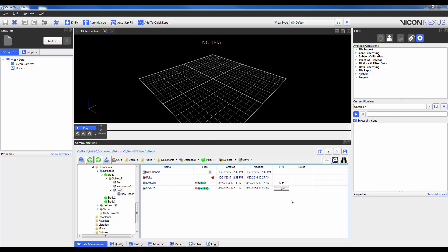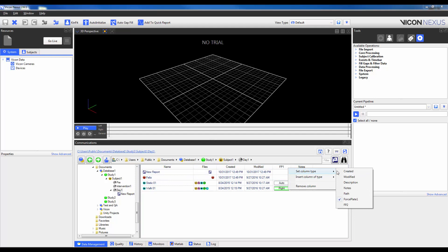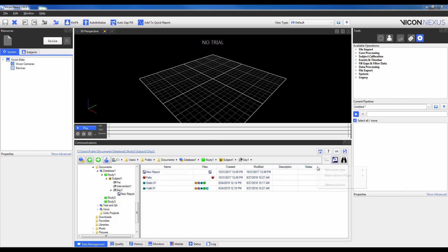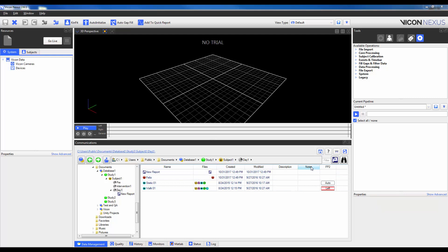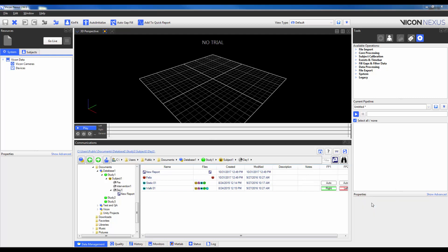If I wanted to make my database look like the default Column Scheme, I can right-click back on the Force Plate and change it to Description. Then I can go ahead and add in two more columns. So I'm going to right-click and insert Column of Type. And let's say I added in Force Plate 2 by accident, that's okay. I can just go ahead and right-click on Notes again and insert Column of Type Force Plate 1. And now you can see here that this looks the same as the default.